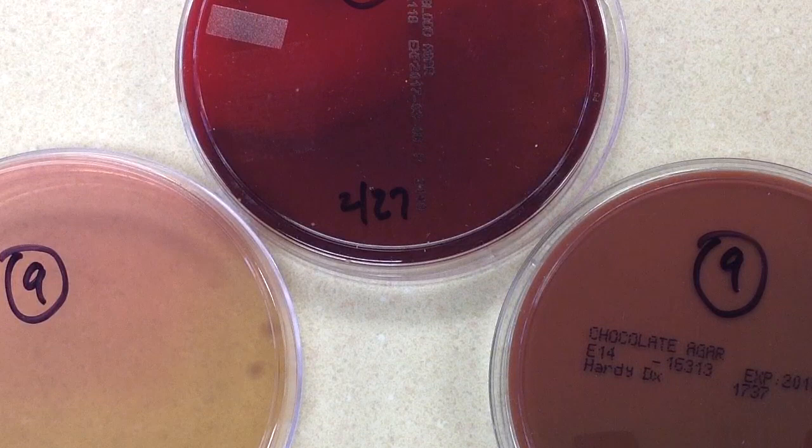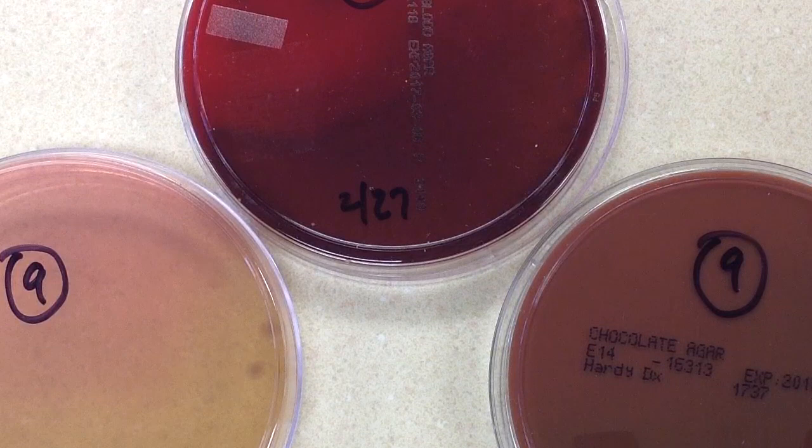We need to send out a preliminary report, and what we're going to say is: probable Enterobacteriaceae — identification and susceptibility testing to follow.